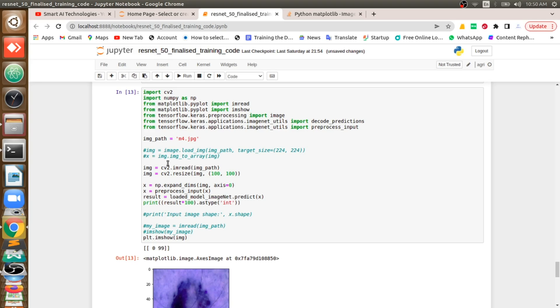Hi, this is Raju from Smart AI Technologies. Welcome back. Today we will see a concept called detecting skin cancer using deep learning. First, I will show you the result.